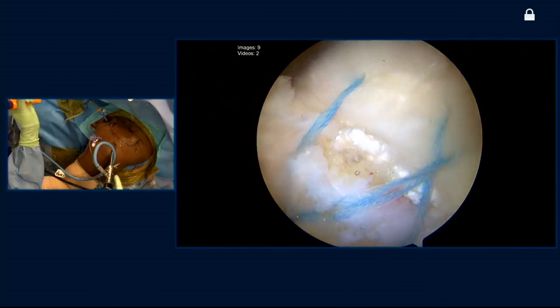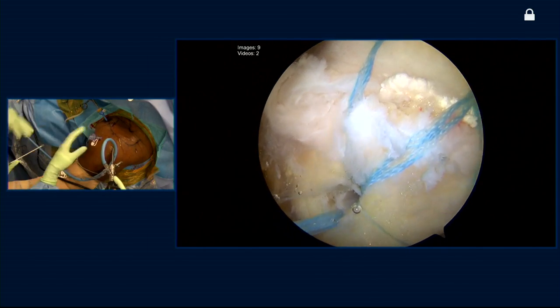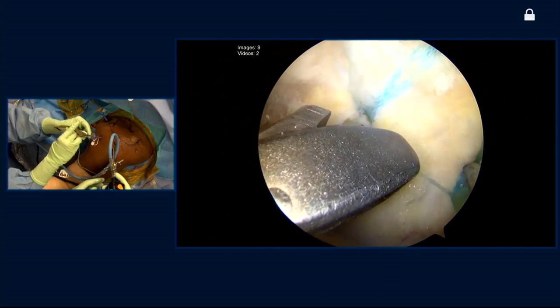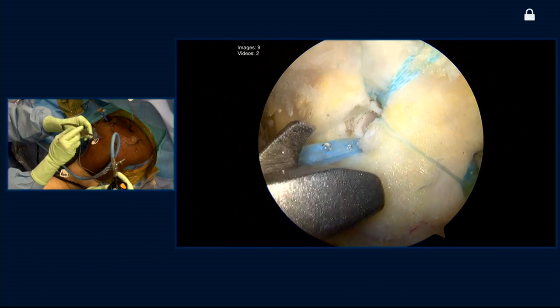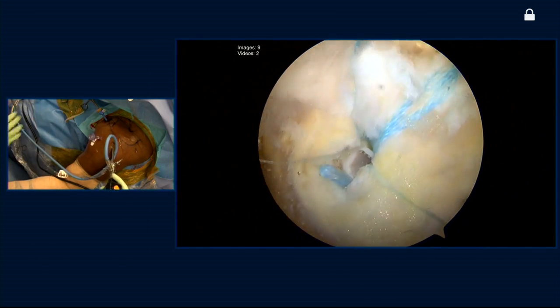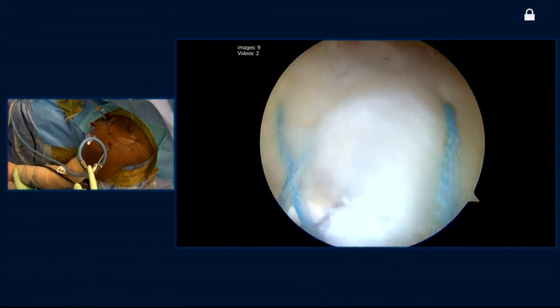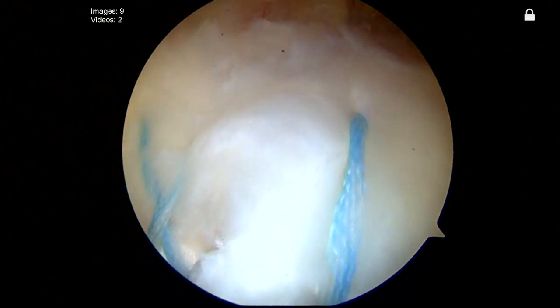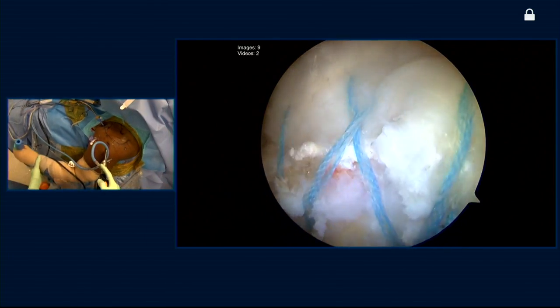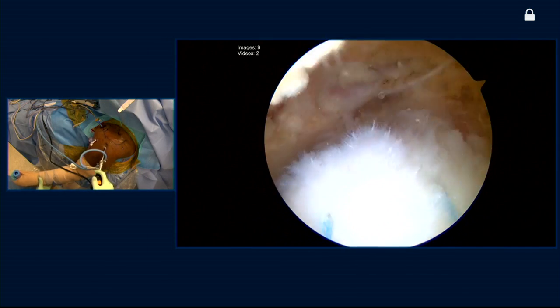So you're finishing up with this repair at this time? Yep, we're pretty good here. We're going to move on to the tenodesis — just going to cut that and show you what it looks like finally. Can you move the arm a little bit just to show how nice and secure all this is? So there's our repair. You can see that we've got a transosseous equivalent type repair. We have a little bit of a dog ear in the back simply based on the configuration of the tear. But you can see as we move it, we've really got very secure fixation of the tendon to the bone. And of course, we've got our acromioplasty up top. So we're pretty happy with that at this point.